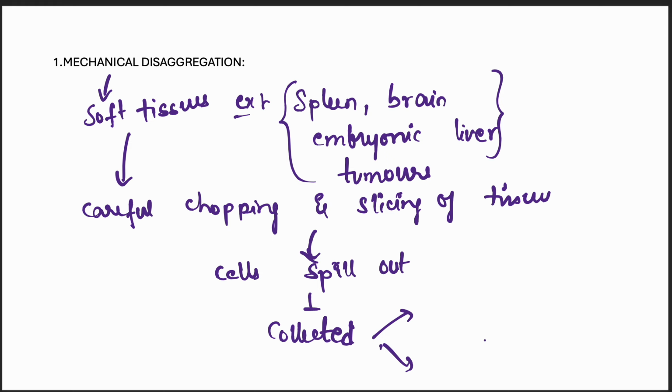One is by pressing the tissue in a series of sieves. Sieves will be having some pore size.